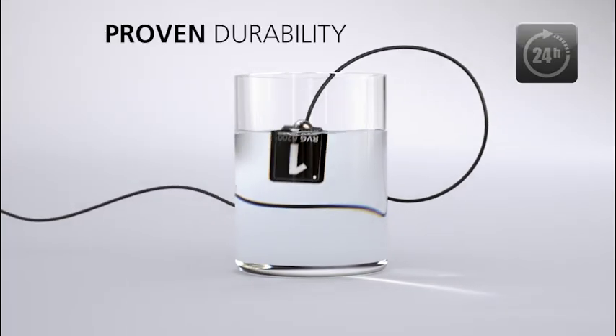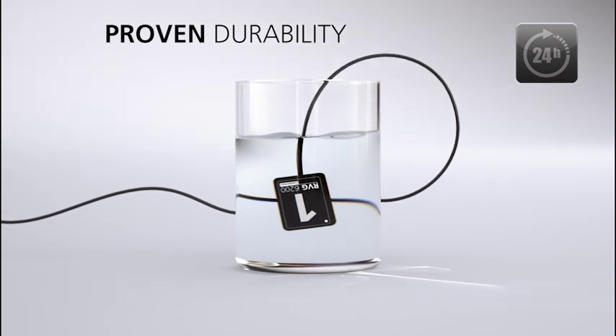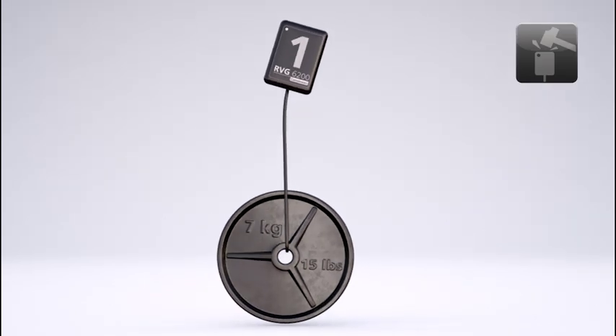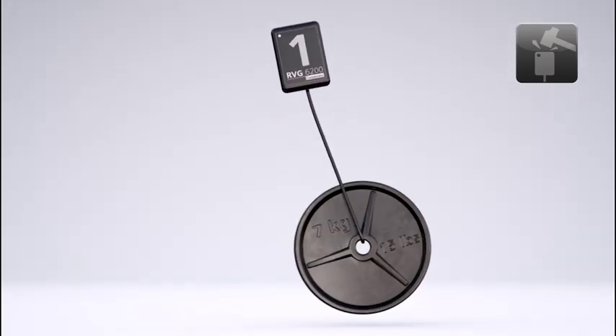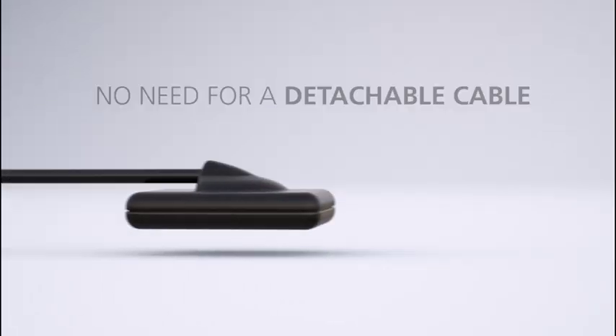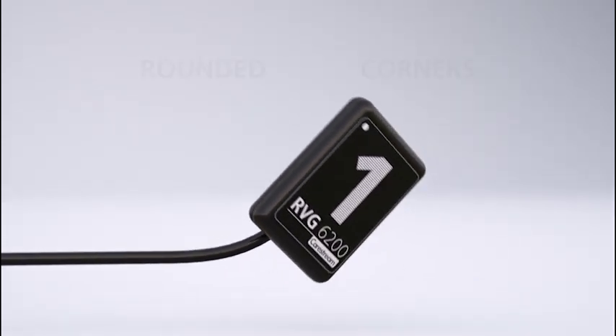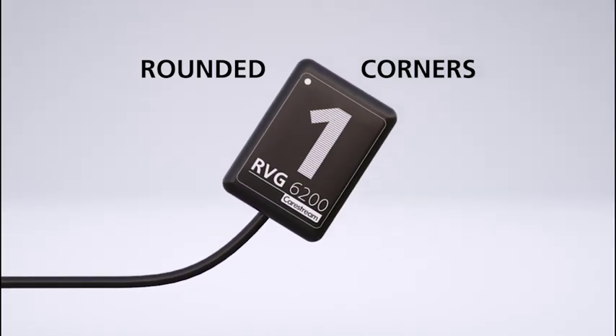Undergoing a 24-hour water immersion test, the durable hardware enables 10 years of intensive use. The cable can withstand up to 7 kilograms or 15 pounds and over 100,000 severe flexions, making a detachable cable completely obsolete. Its rounded corners further enhance patient comfort.